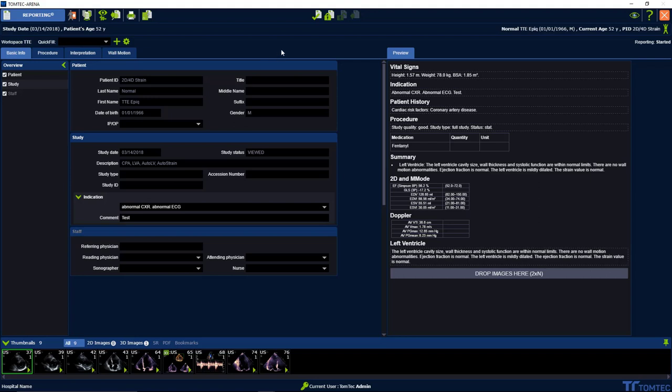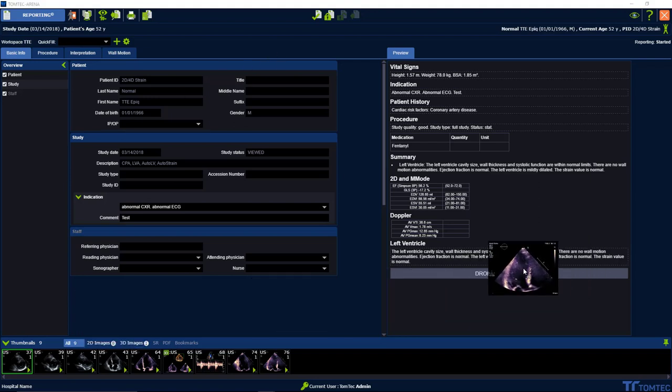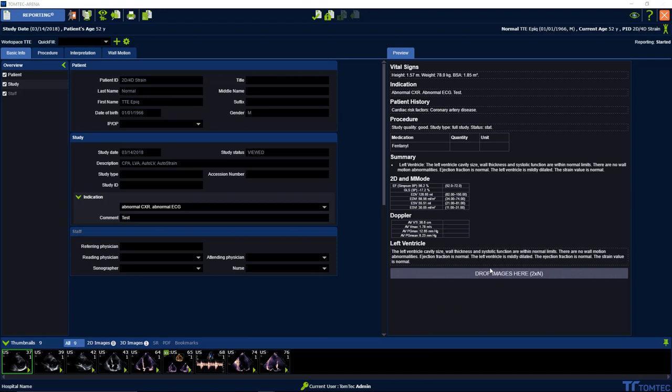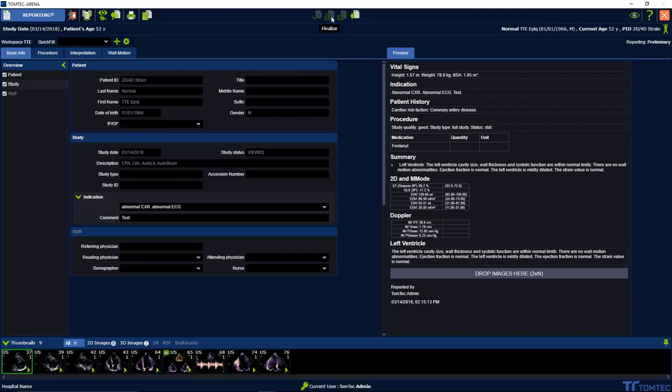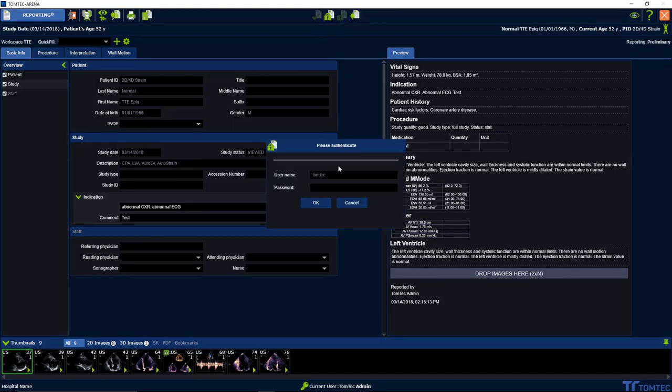Last but not least in the reporting module, we can drag and drop images from image com in the reporting. Now how to organize my report. On the top you can see two icons. The first one is set the report to a preliminary, and the second one is to finalize my report.